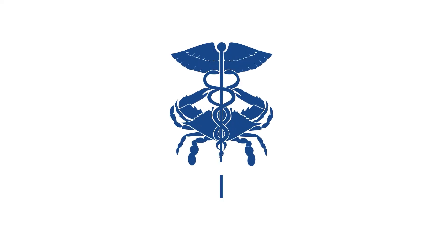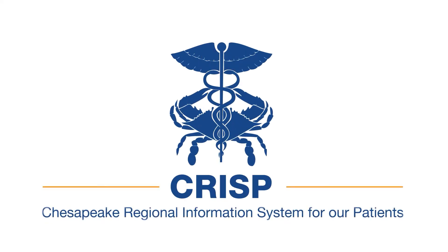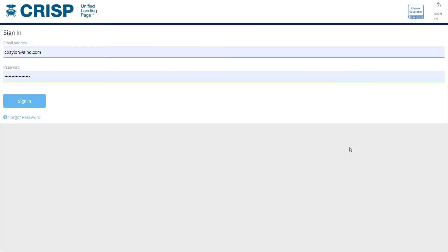Welcome to an overview of the CRISP COVID-19 Point-of-Care Results Reporting Tool. This tool is designed to provide organizations who are performing point-of-care COVID-19 testing with the mechanism to report results to the Maryland Department of Health, all within their existing CRISP Unified Landing Page account.